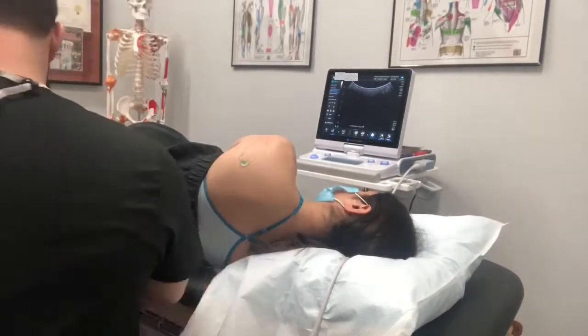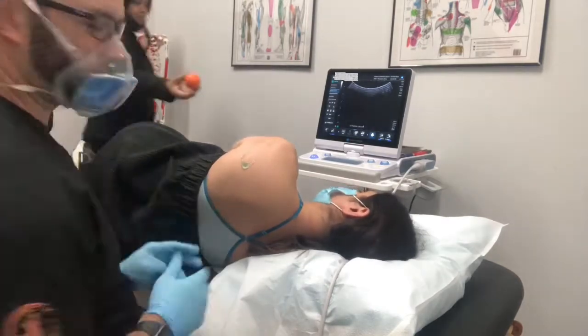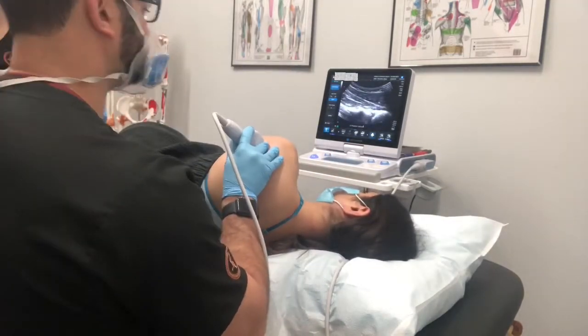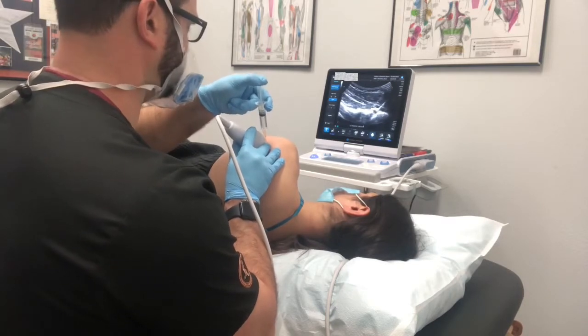Today we are doing prolotherapy to treat a patient's injured rotator cuff. First we get the area all cleaned up, numbed up, and then we get the area injected with the prolotherapy solution.